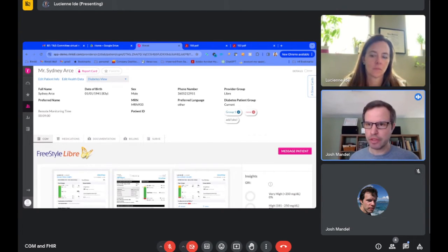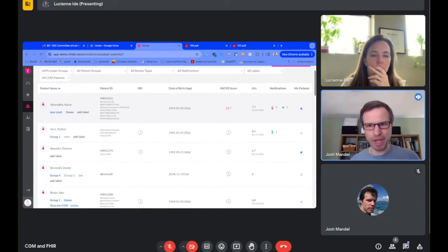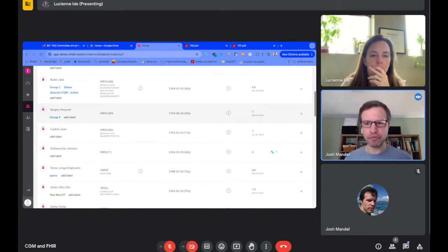I want to prescribe you this device. At that point, the clinician knows that they have an EHR integration with Rimidi. They know that there's two or maybe soon three different device vendors that are supported. So today, the clinician can say, "Great, I'm going to prescribe you an Abbott device or a Dexcom device," maybe based on their own preferences or based on price or some conversation with the patient. They could sort of have their pick.